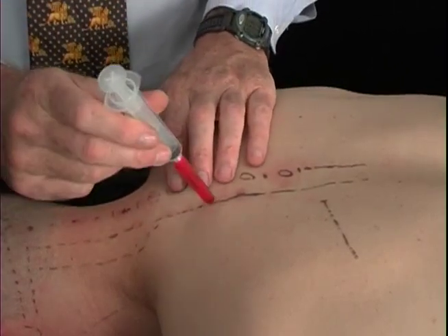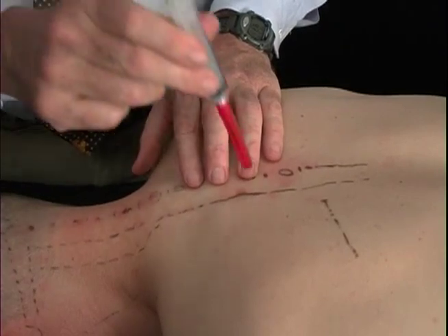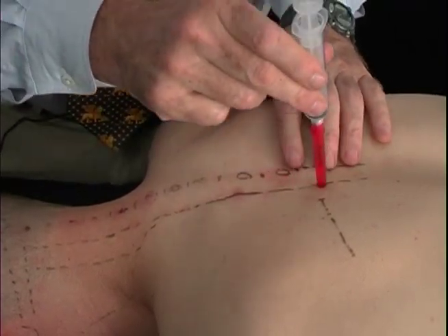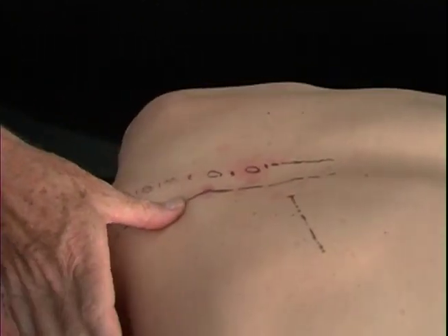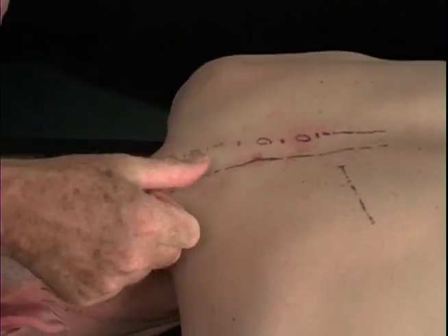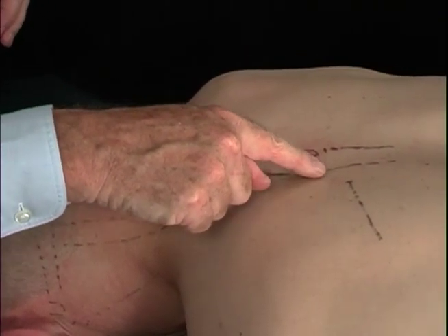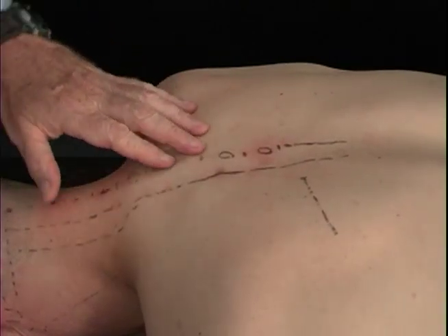When we're first starting these injections, I recommend doing individual injections, just pulling the needle clear out, and moving right on down, meticulously injecting this area. And of course, we've already palpated with our thumb or forefinger, and moved right on down, individually finding the tender areas and focusing on those tender areas for injection.